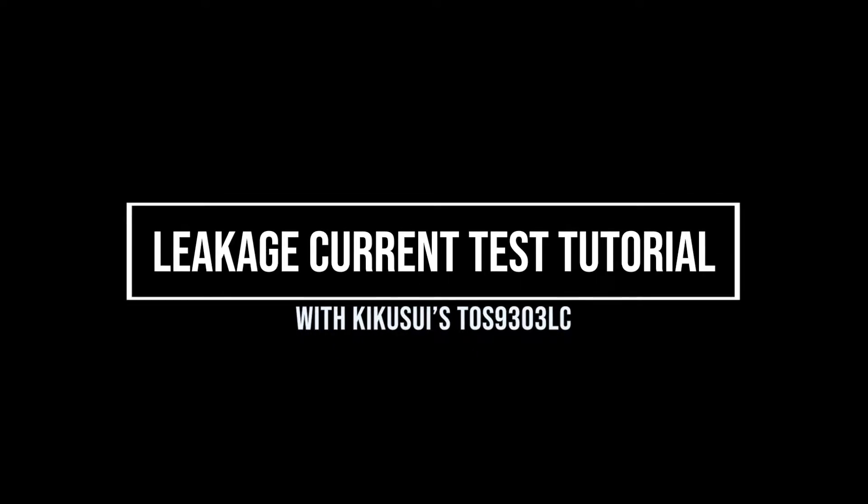Hello! For today's tutorial, we will demonstrate how to conduct a leakage current test with KIKUSUI's TOS9303LC analyzer.